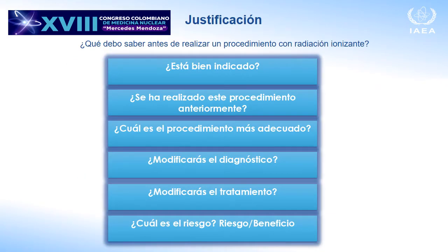Now, let's talk a little bit about justification. That is, what should I know before performing a procedure with ionizing radiation? First of all, is this procedure well indicated? Has this procedure been done previously? This is very important, because should we repeat or not? What is the most appropriate procedure? We have to look, for instance, for a procedure that doesn't employ ionizing radiation. Will you modify the diagnosis after this procedure?